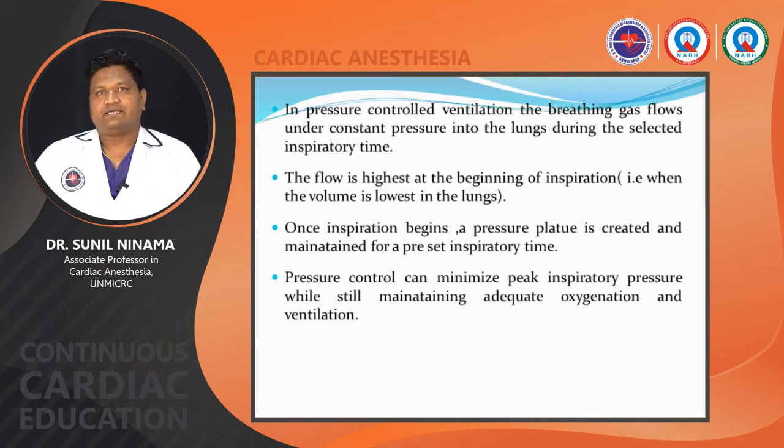The flow is highest at the beginning of the inspiration, when the volume is lowest in the lung. Once the inspiration begins, a plateau pressure is created and maintained for a preset inspiratory time. The pressure control can minimize the peak inspiratory pressure while still maintaining adequate oxygenation and ventilation.